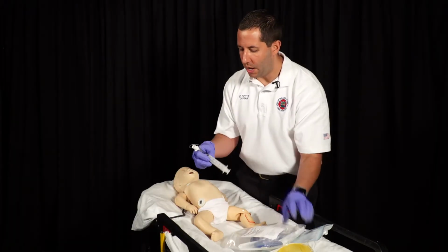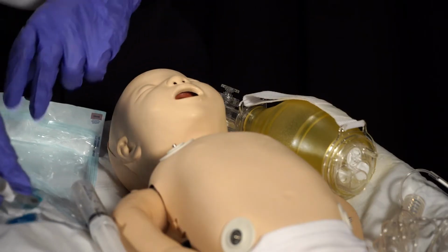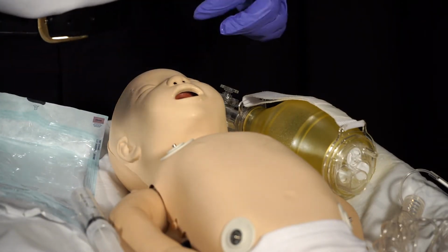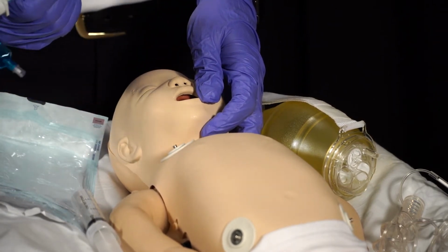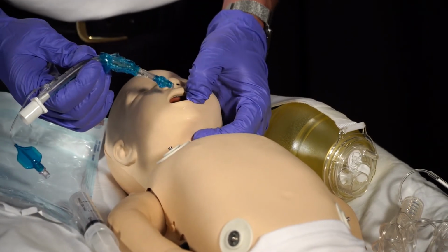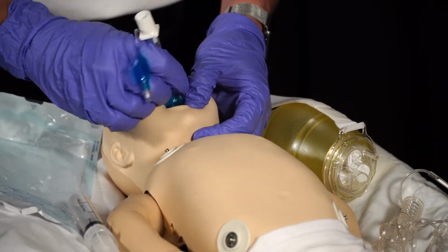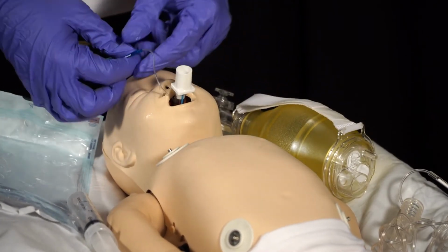Go ahead and get my syringe ready with 20 mLs of air. Okay, now I'm going to show the insertion of the King Airway. You're going to make sure the child's head is in the neutral position. After that, you're going to lubricate the distal end of your tube, and perform a little bit of a modified jaw thrust where you pull the child's jaw down. As you do that, you're going to insert the King Airway until you can go no further.